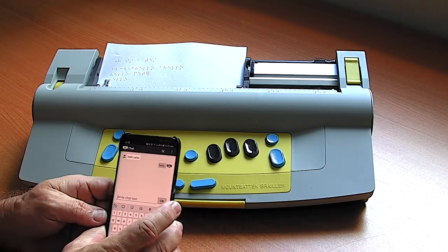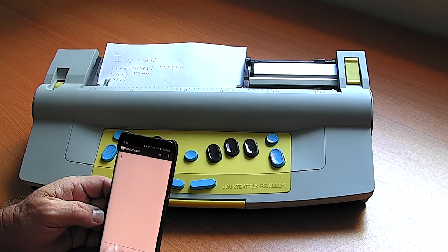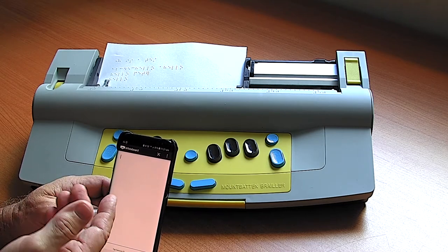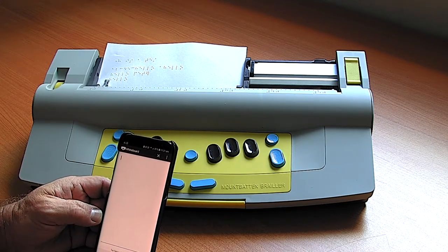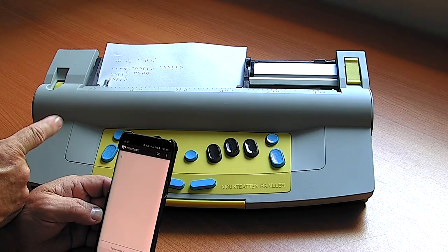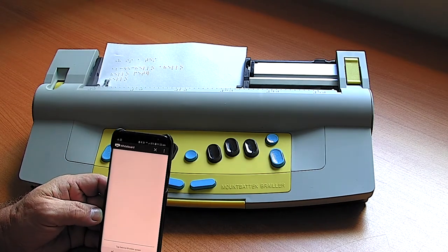Another very useful feature is called the whiteboard. You can type word for word and it will be instantly typed up, but you can also paste content from the internet or a word processor into the whiteboard area and have it embossed straight away on the Mountbatten. Simple spelling lists could be embossed on the Mountbatten, the child reads it, puts answers back in Braille, and the teacher aide or parent can see how they're progressing with their assignment.